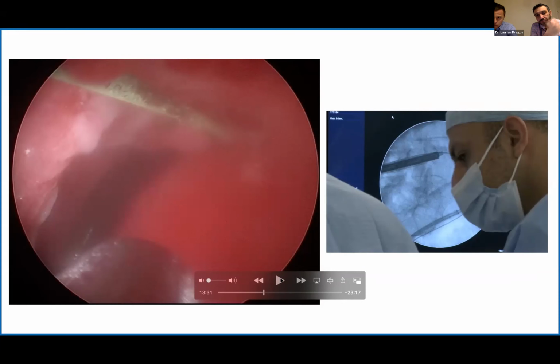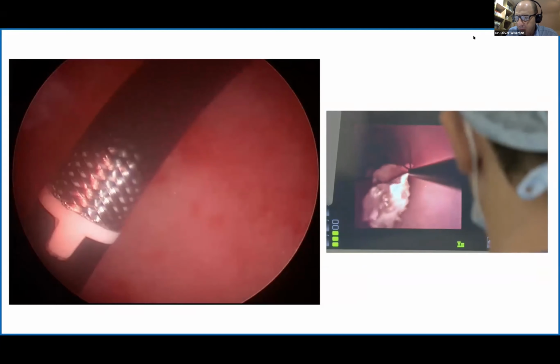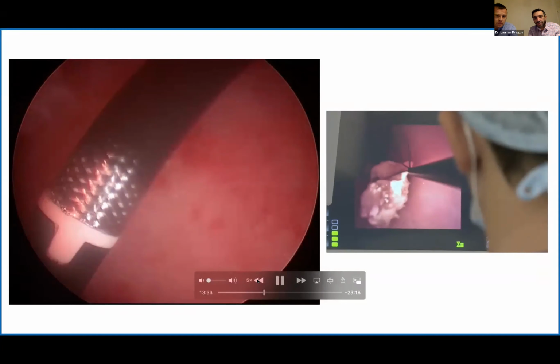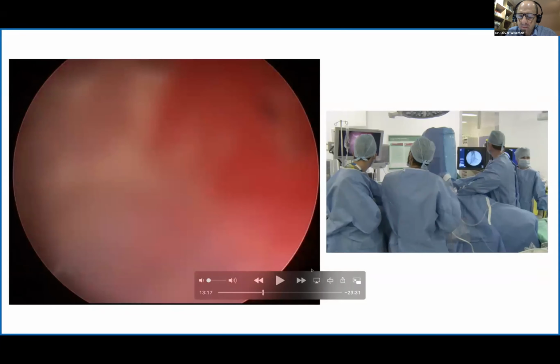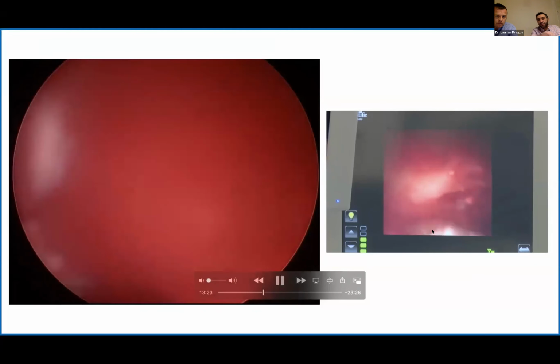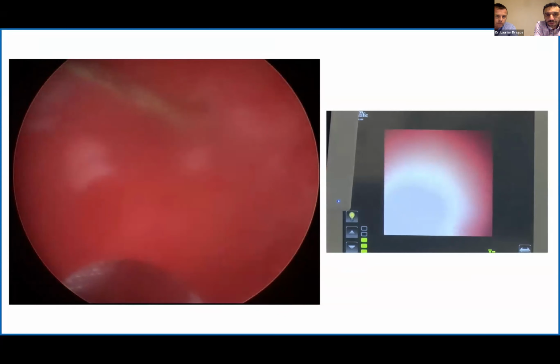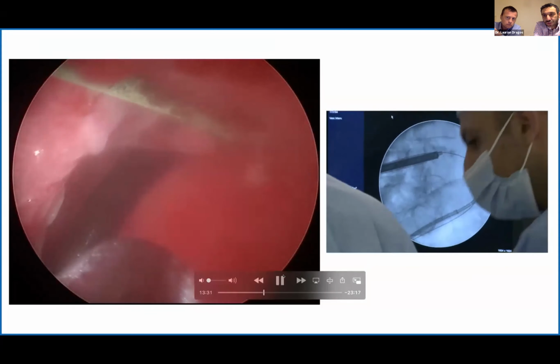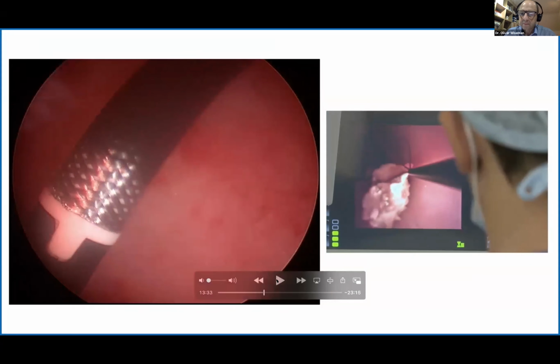Yeah. Okay. And it looks on the image intensifier that we just saw, Laurian, like you're poised and waiting to get access up into the kidney for Kasra to free up the PUJ. Is that right? You're just ready and waiting, really. Yeah, exactly. So Laurian was there waiting for me to clear the access area. And you're using a disposable flexible ureteroscope, so we're not too concerned about damage to the scope, because we'll be disposing of it later on.